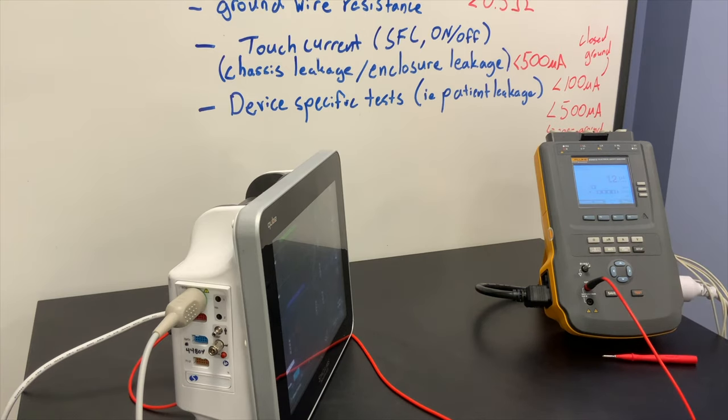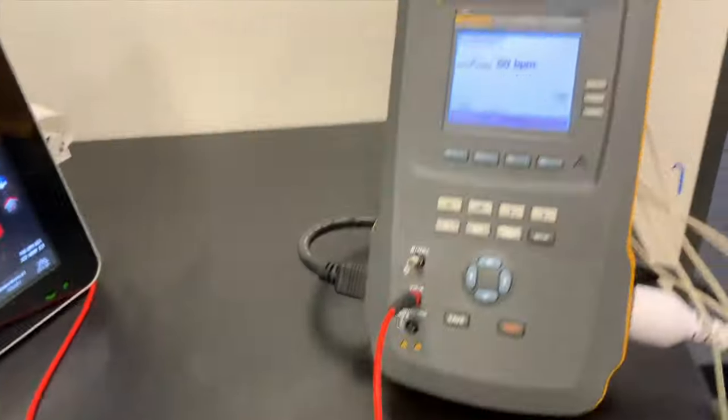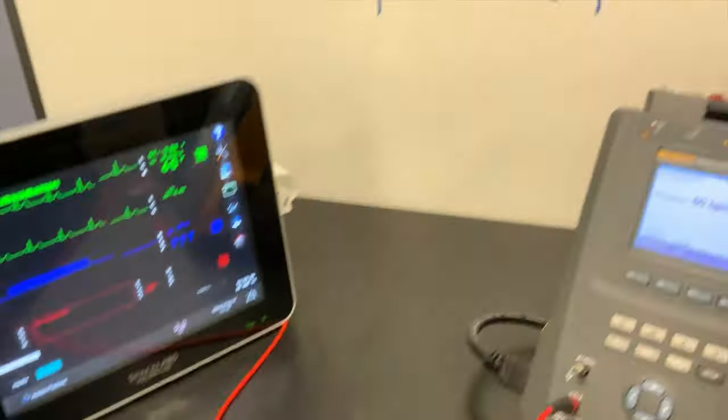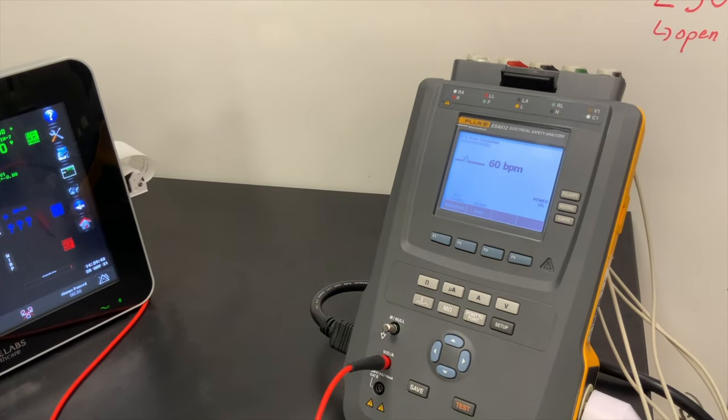You can also measure current. This tester has a patient simulator built into it, which is kind of interesting. I can do a little basic patient simulation — for example, if I want to generate a 60 beats per minute ECG I can get that displayed on my patient monitor. But this only does ECG, so to me it has pretty limited functionality.